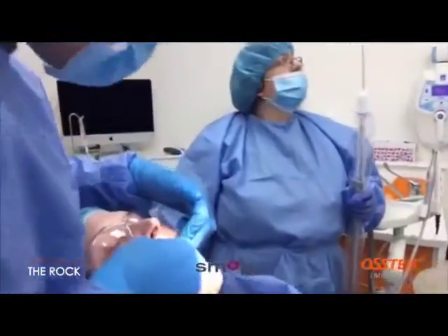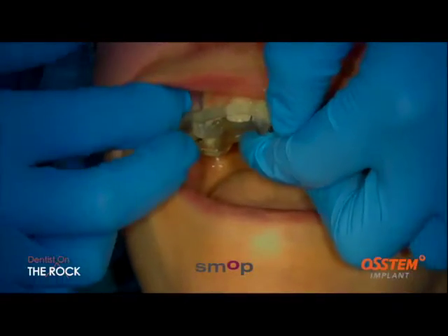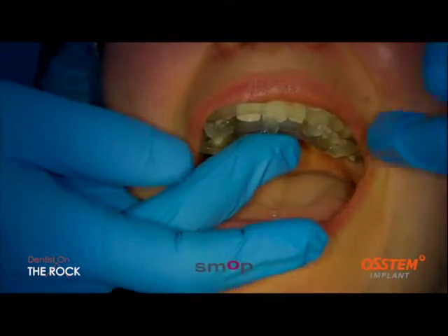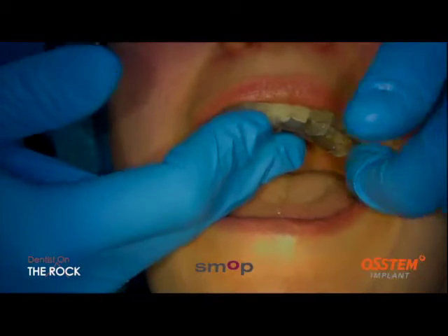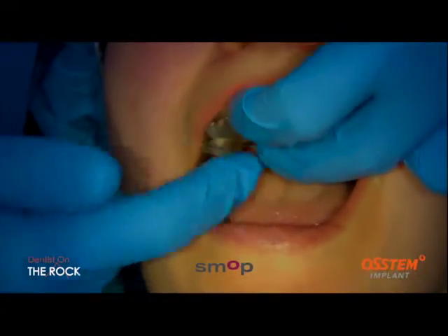Like I said when I was teaching yesterday, I don't like it engaging too much undercut and flexing and clicking into place. I'd rather it be a passive fit, but I still want a little bit of retention, and there is. But what I'm doing, I'm checking on all the points to make sure that the guide is sitting down on all the four or five places where it's connecting. So here, here, here, here, and here.